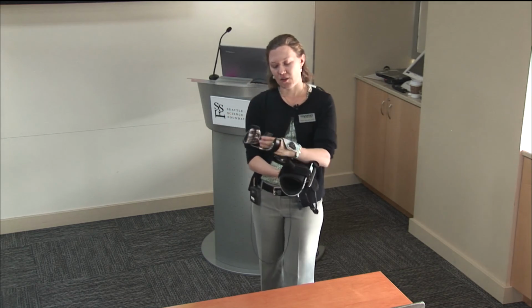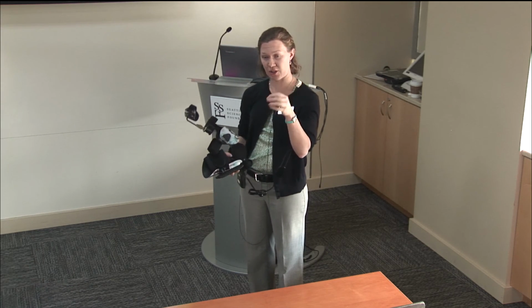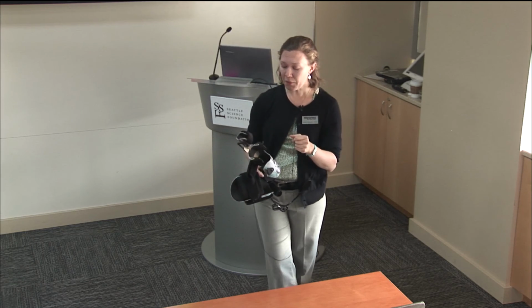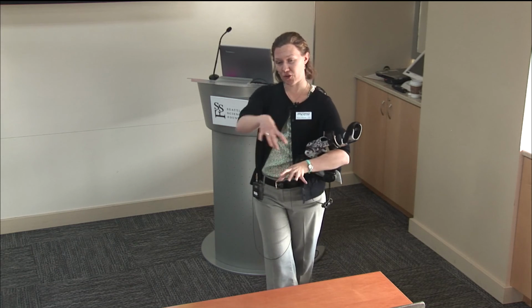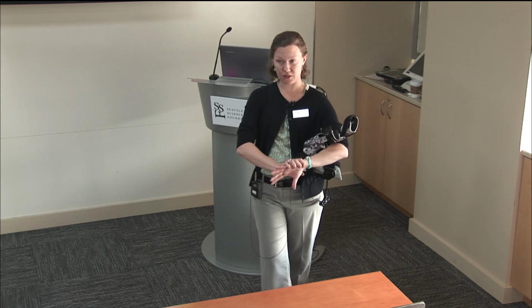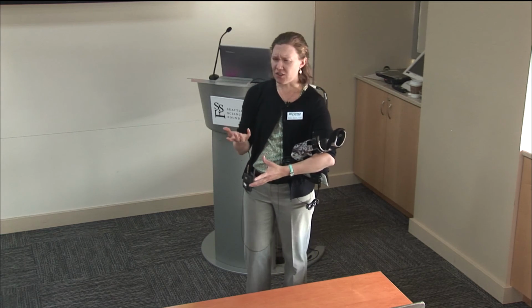This can be set so that it is totally free. So if you think of that patient with like a brachial plexus injury who still has full hand and wrist motion, you can set it to where it's totally free. They can move their hand at will. You can also set it to where there's a high tension on it so that patients can reach across and pre-position it into the position that they want it, and it will hold there. Or if for some reason you wanted to, you can totally lock it down.